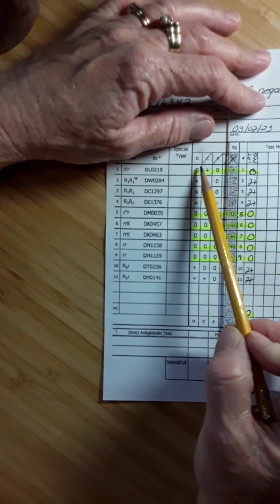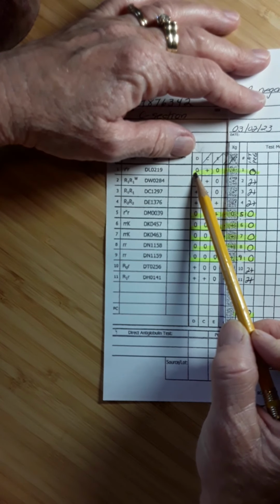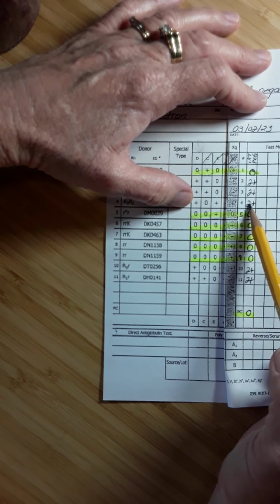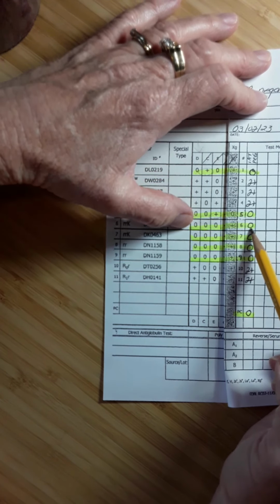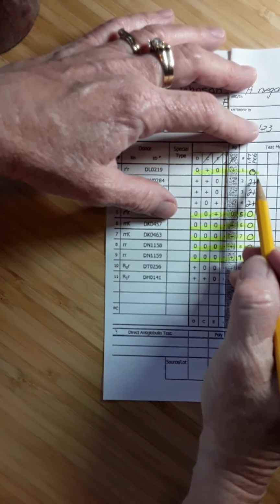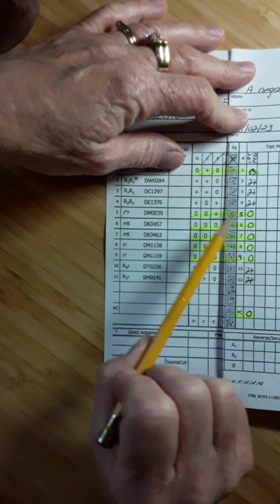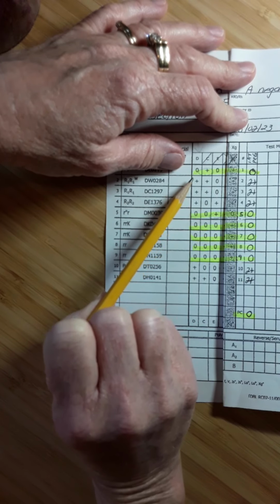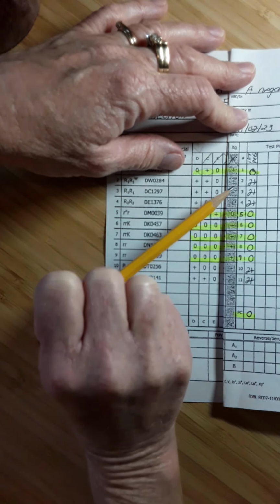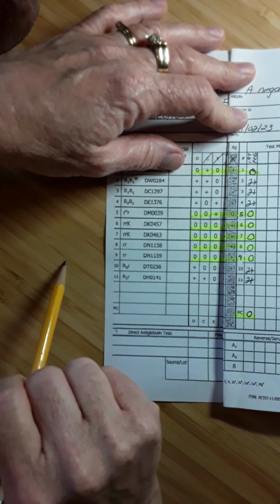So looking at D, C, and E, I'm looking for negative. Okay, well, sure enough, under the D, panel cell 1 is negative. And then I'm looking for 3 positives. And then I'm looking for negative, negative, negative, negative, negative, plus, plus. Can you see that this pattern exactly matches what we would expect if the patient's plasma contained an anti-D? Negative, plus, plus, plus, a bunch of negatives, plus, plus. Does that make sense, you guys?